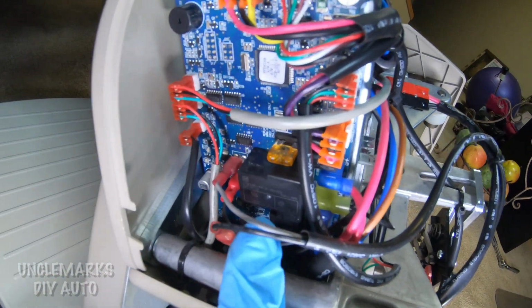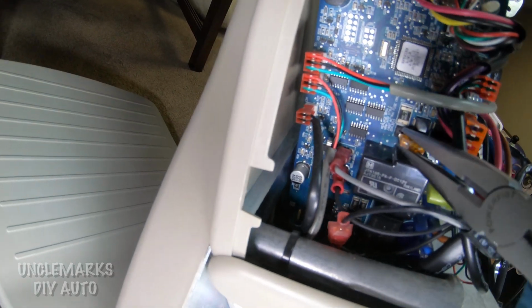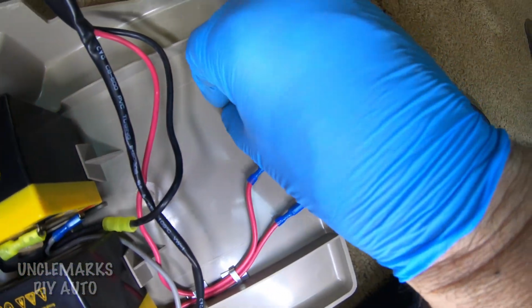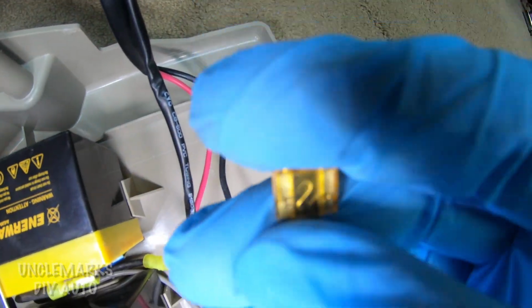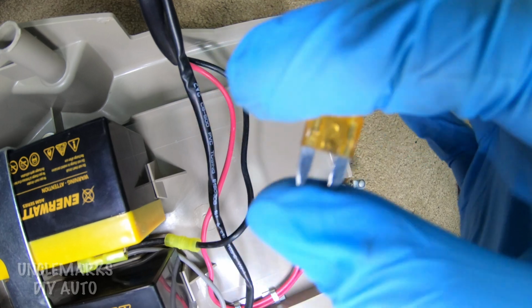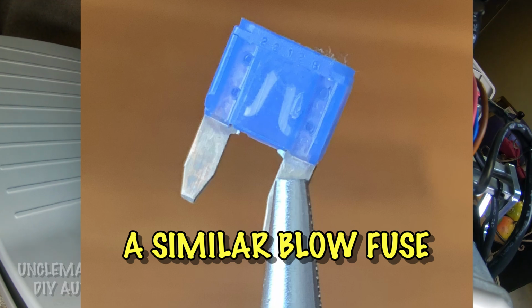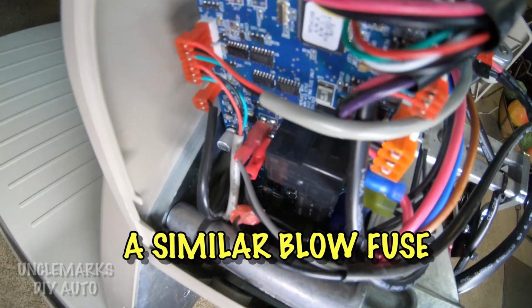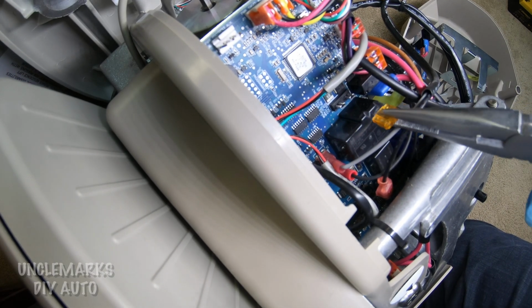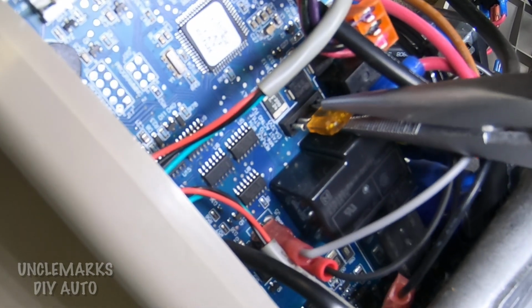Now this one, I blew a fuse, and I was trying to find where the fuse is, and there it is right there. It's kind of an orange fuse. This is just a 12 amp fuse from a car. If we take a look, this one's good now, but I'll show you what it looked like with it blown. That's what it looks like blown. And we will put this one back in. Not the easiest thing to get back in there. Luckily for me, I've got my super duper needle nose pliers, and we'll just put it back in. Simple enough.